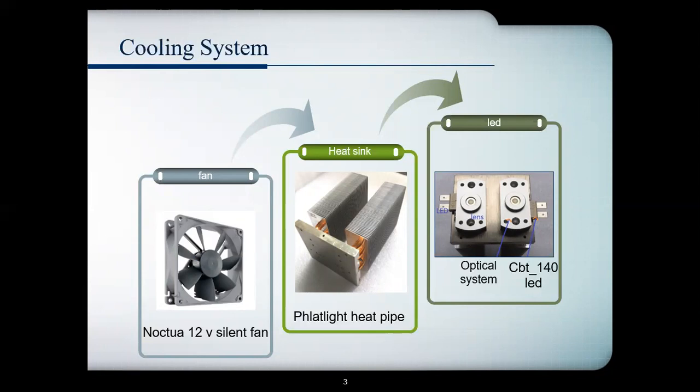The heat pipes contain specific fluid that helps in the heat transmission. So, on the LED side, the heat is transferred to the heat pipes and the fluid inside it will start evaporating towards the aluminum side, where all the heat is transferred and the water gets back to its liquid state and returns to the LED side for collecting more heat.